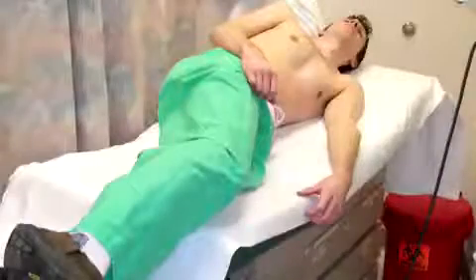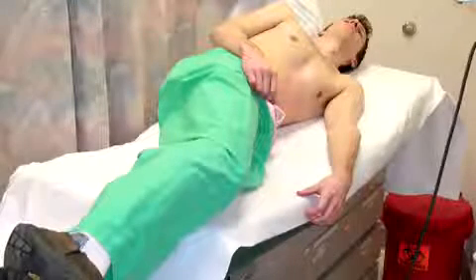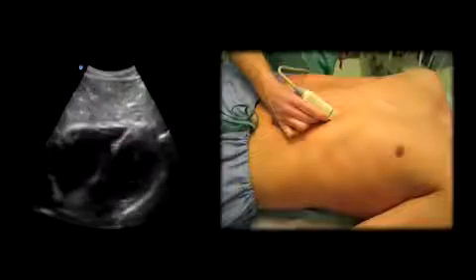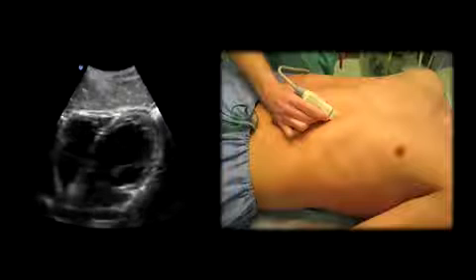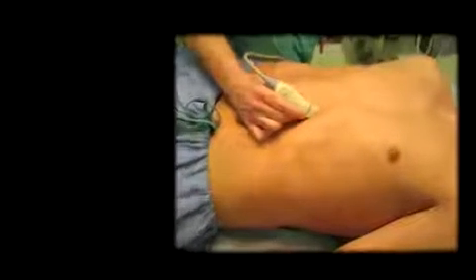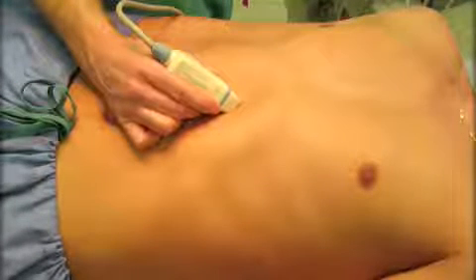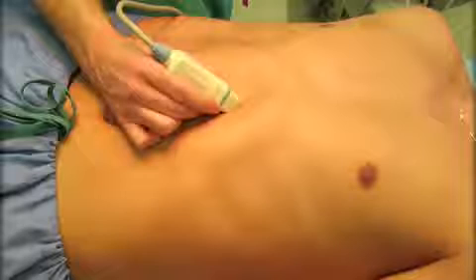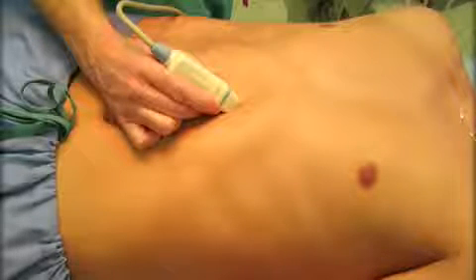The patient should be in the left lateral semi-decubitus position, but this may not be possible in the emergent setting. The subcostal view may be the easiest to obtain in a critically ill patient who is in the supine position and cannot fully cooperate with the exam. The probe should be placed in the subcostal location with the probe marker dot pointed to the patient's left side. The probe should be aimed towards the left shoulder at a very acute angle to the patient's abdomen.